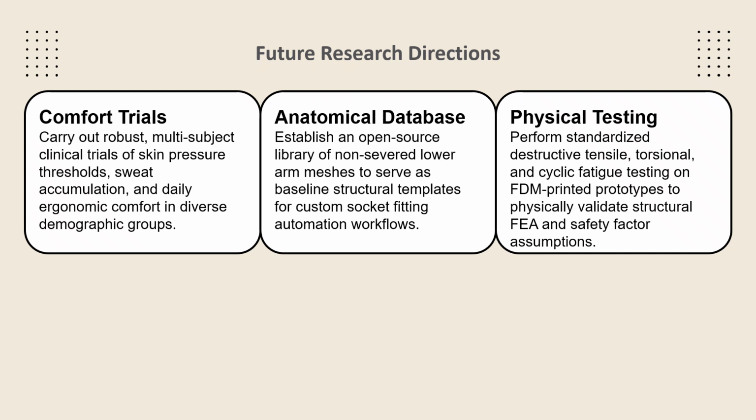While the current methodology validates the mathematical and geometric foundation of this workflow, we identified 3 key pillars for future research to bring this concept into standardized clinical environments. We will first run multiple subject clinical trials to measure patients' comfort. We will monitor localized skin pressure thresholds, thermal sweat accumulation within the 2 mm liner gap, and long-term ergonomic comfort in different demographic groups.